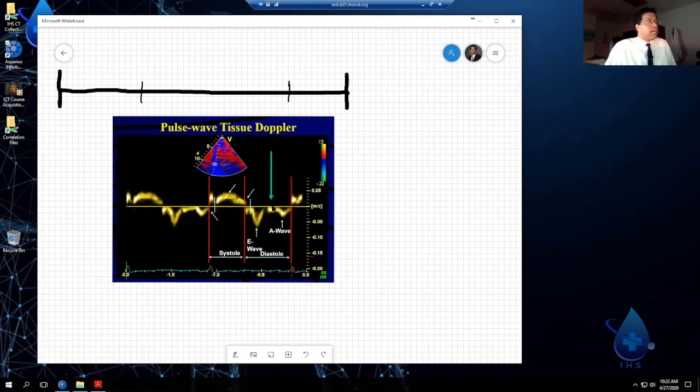All I'm teaching you right now is nomenclature. You probably know this by milliseconds of the cardiac cycle, but never thought of it in percentages. But percentages just give us an accurate way to tell you where we are in time on the Wiggers diagram or the cardiac cycle. Okay?